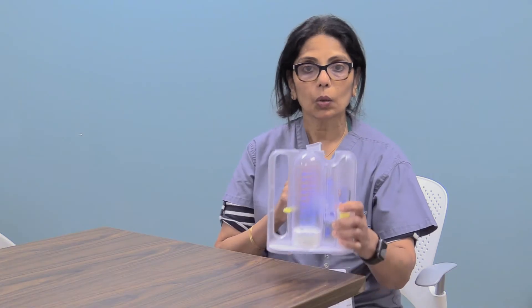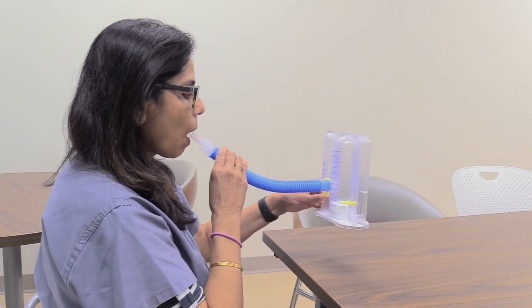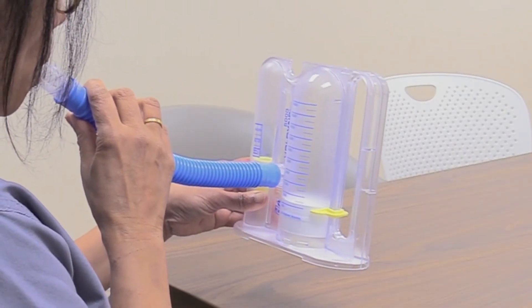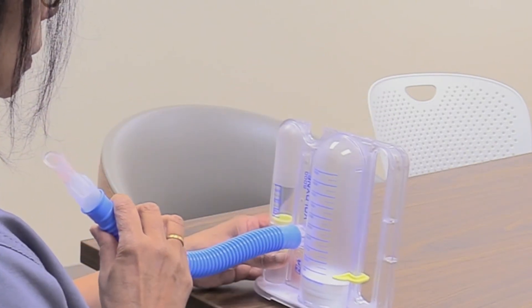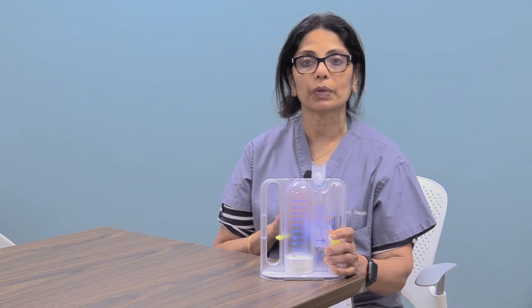Now to begin, sit up as straight as possible. Hold the IS upright and place the mouthpiece in your mouth, sealing your lips tight around it. Now start to inhale deep and slow through your mouth and you will see the piston rise. When you get it as high as you can, remove the mouthpiece and hold your breath for at least 3 to 5 seconds.